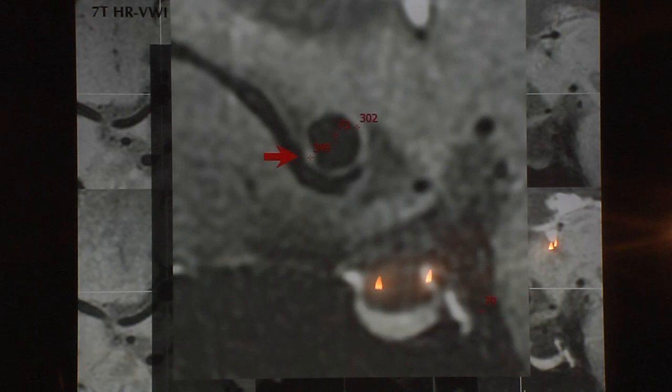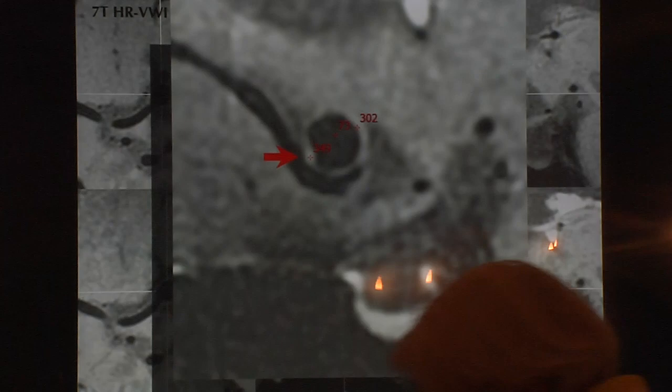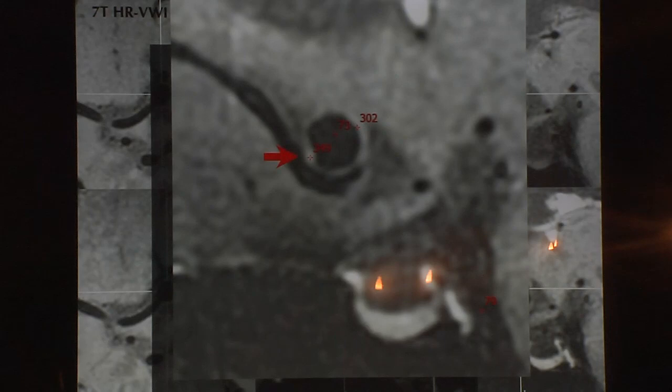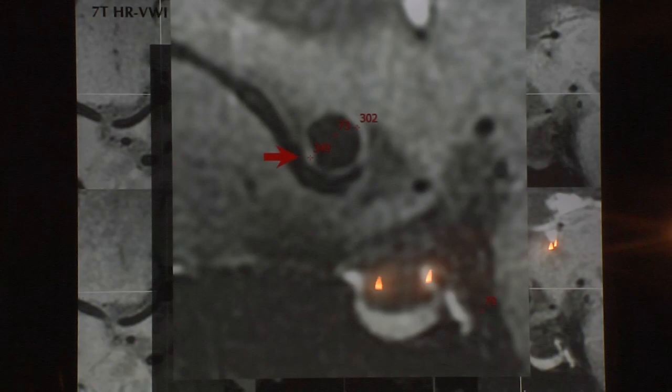The enhancement is mostly uniform, but we notice that some areas of the wall enhance more than others, and some parts don't enhance at all. This tells us that the aneurysm wall is like a microenvironment — it's a process that keeps changing all over the aneurysm, not a uniform process.